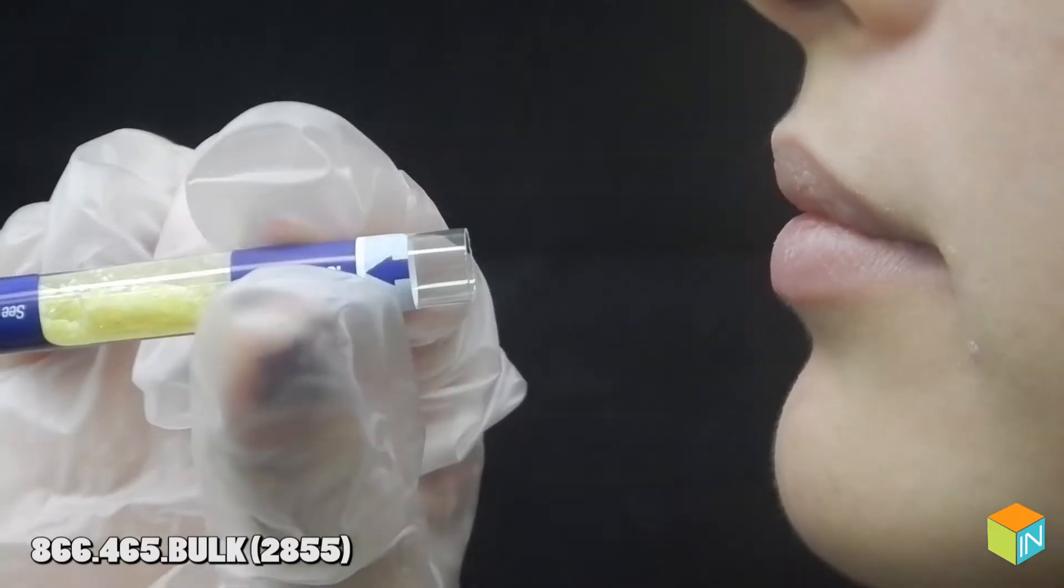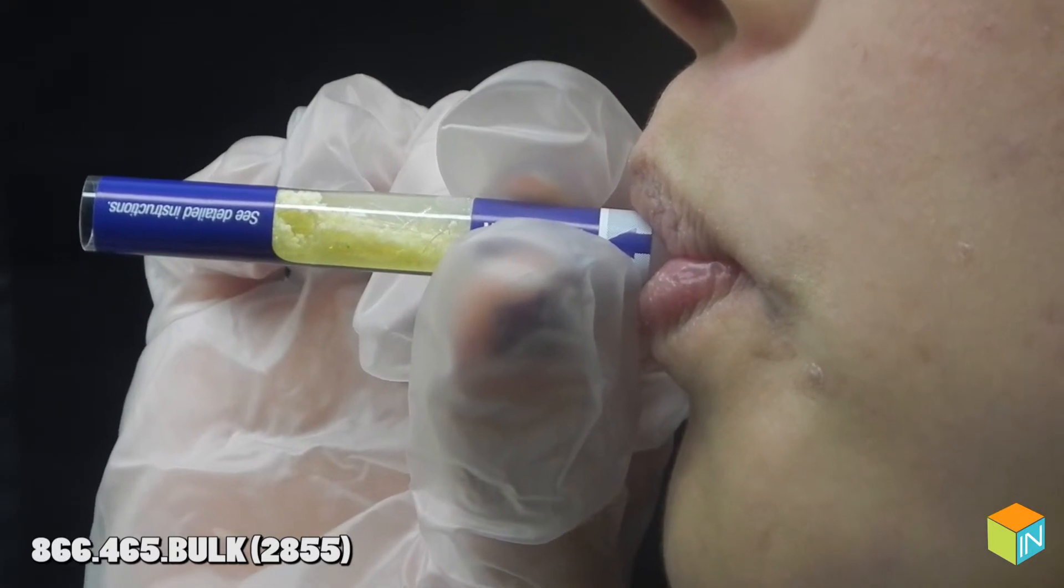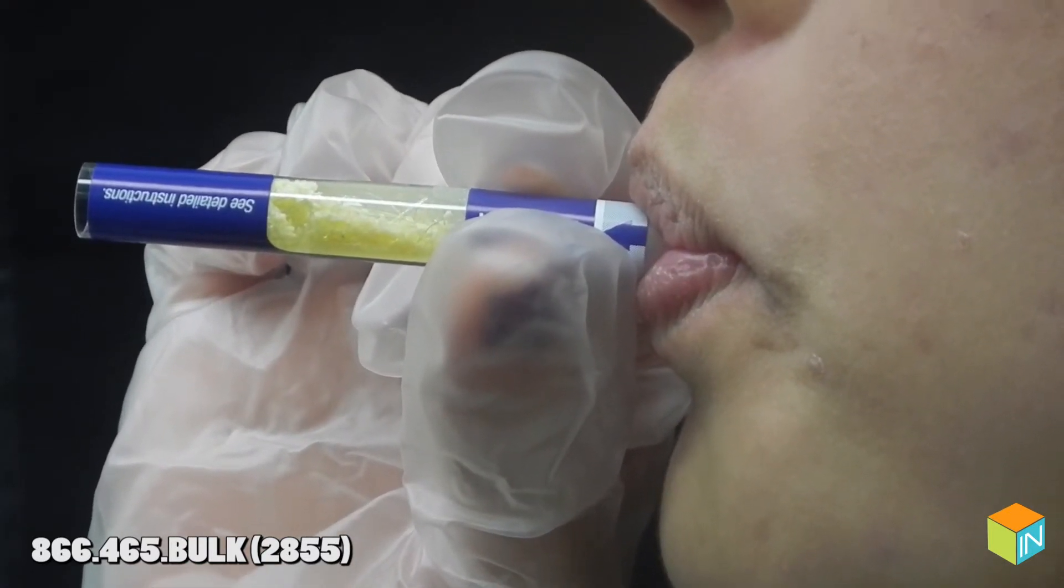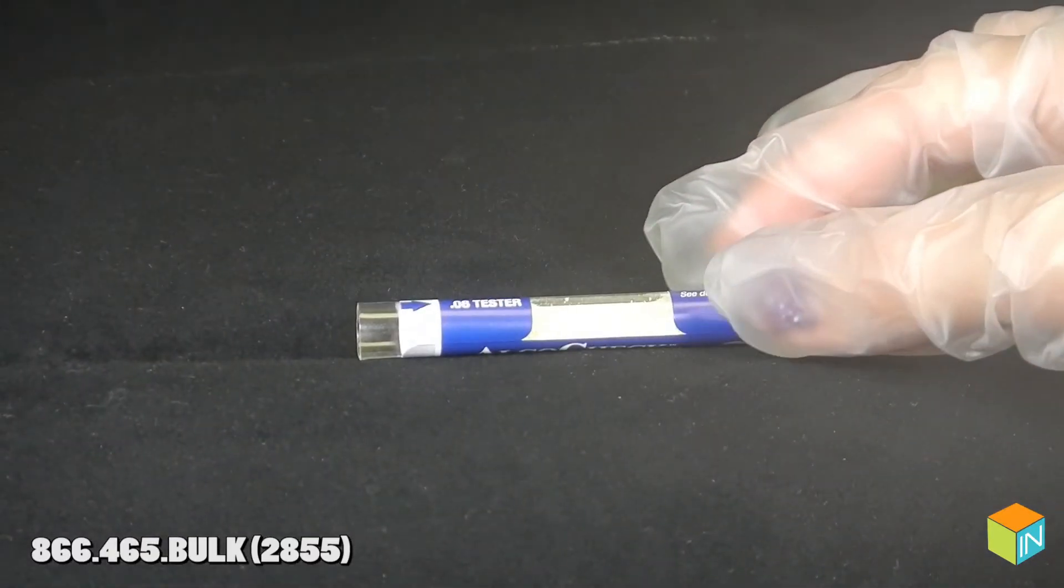Step 3: Blow hard into end of test for 12 seconds, one continuous breath. Do not inhale through the test. Lay test flat and wait 2 minutes.